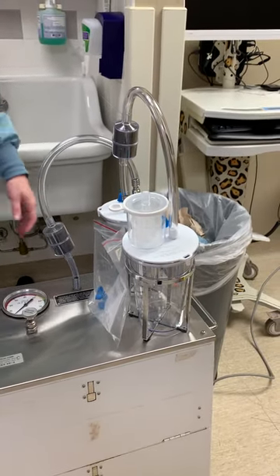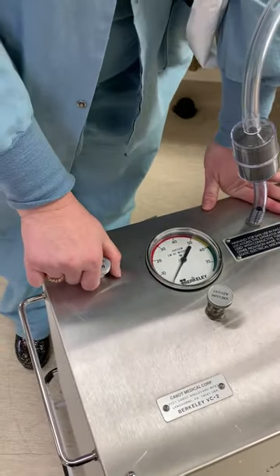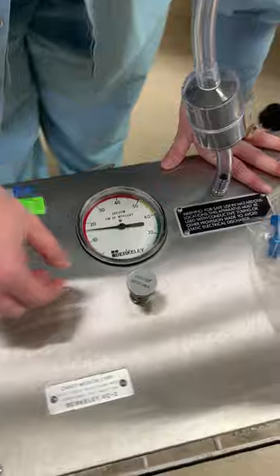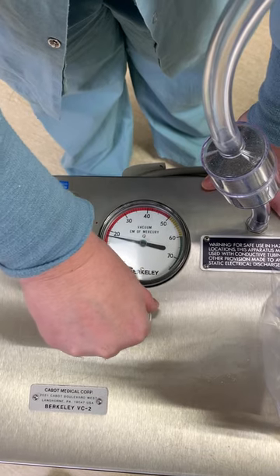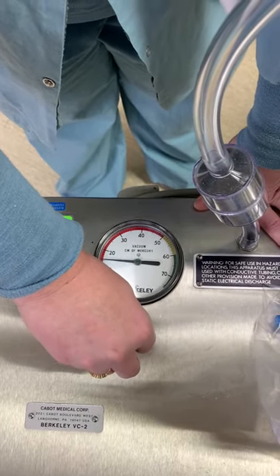Once you get that hooked up, this is how you turn it on — you just pull up. It'll turn the vacuum on. And then if you need to adjust it, you just turn this knob to vacuum adjust. It's usually set at about 15, and the physician will let you know if you need to adjust the vacuum.